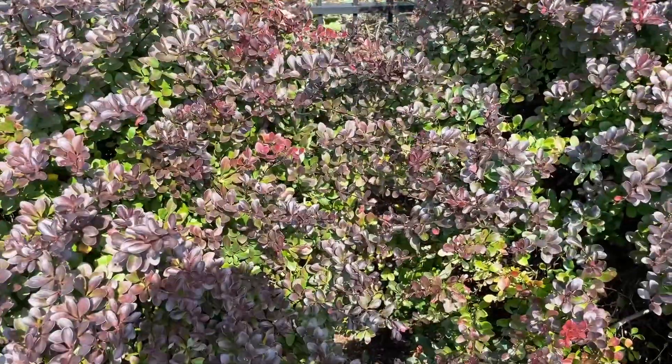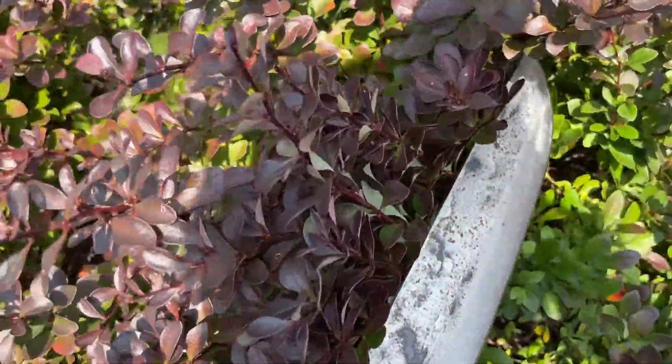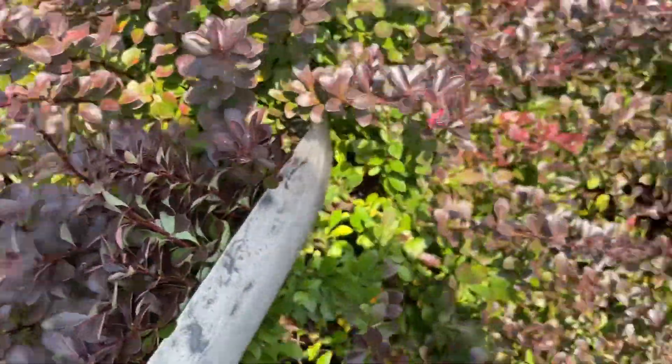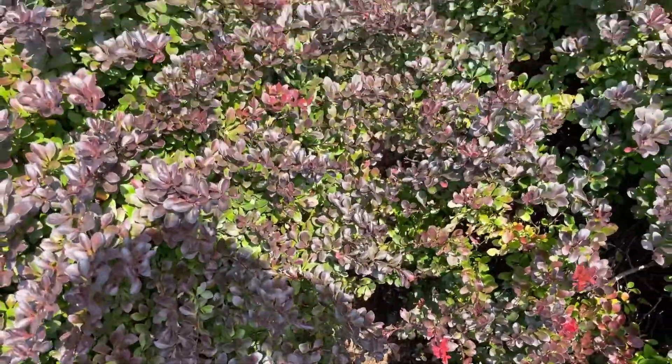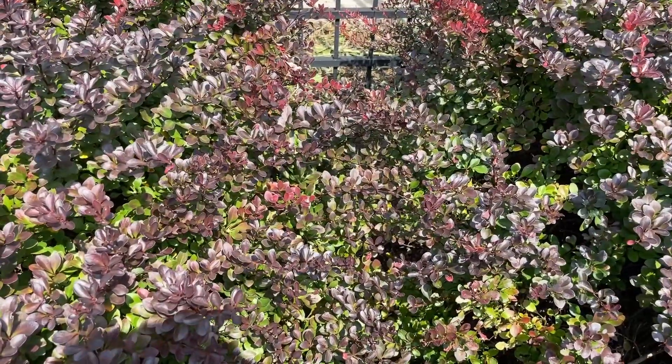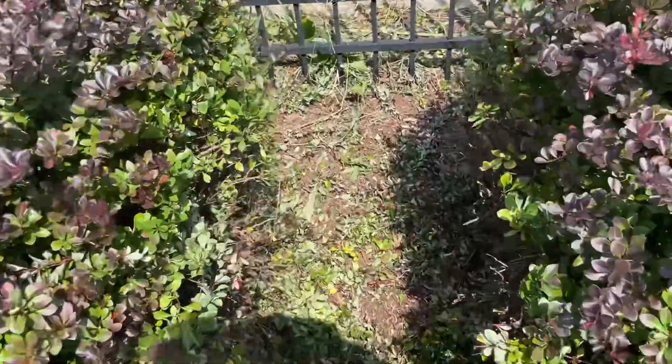Here's the chiller here and in the way are these thorn bushes. If you haven't seen these bushes up close, they are nasty. So I'm gonna cut me a path through here — nothing like a little HVAC landscaping, right? That's more like it. Looks good if I say so myself.